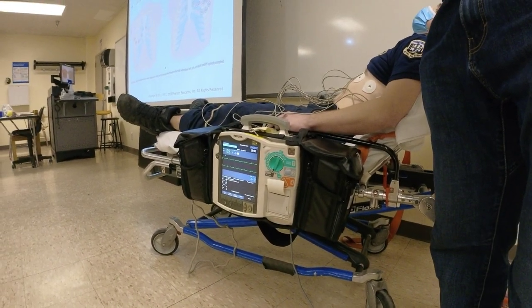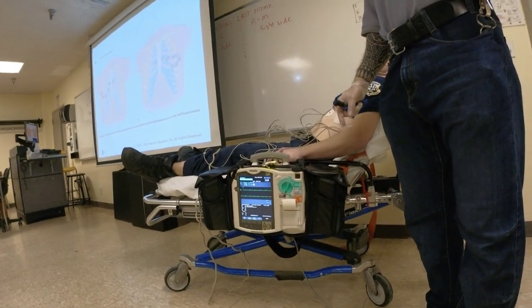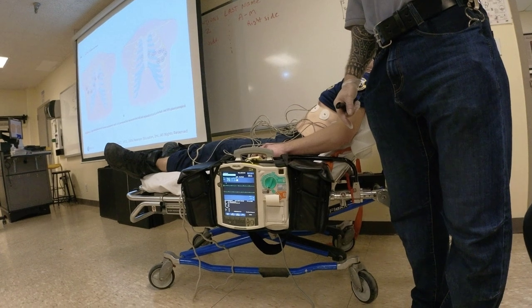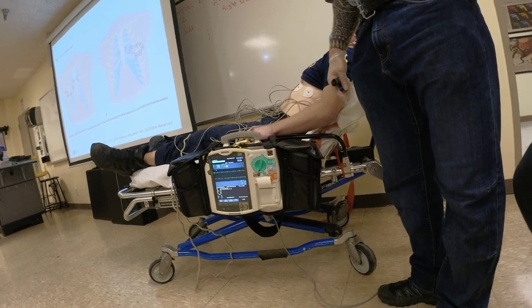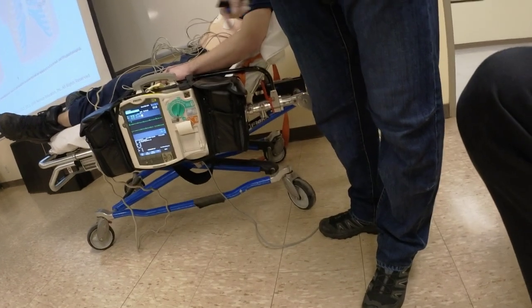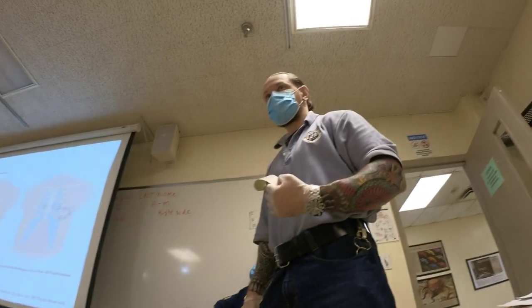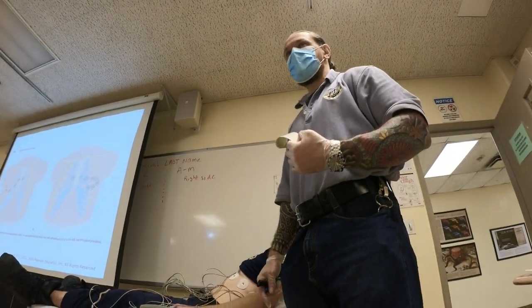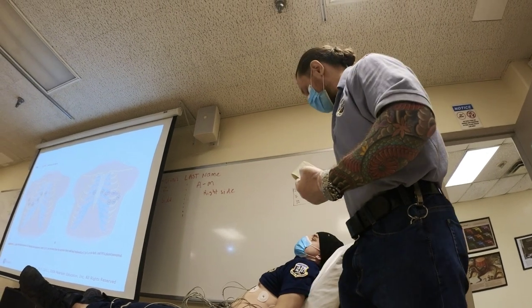I'm not gonna do serial 15 lead EKGs. I'll probably move those to the front, back to where they were. I will do definitely serial 12 lead EKGs. Everybody follow? If you believe he's a high risk patient, you could also put pads on him, defibrillation pads, in case you need to cardiovert or you need to defibrillate him. Especially if he has frequent PVCs, right? Because he may go into VT phenomenon. We talked about that. What else?